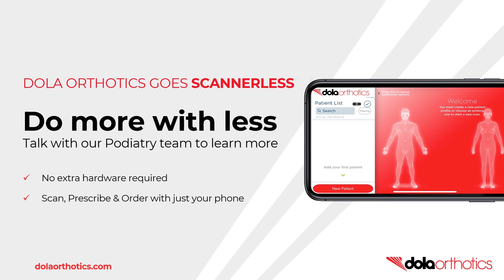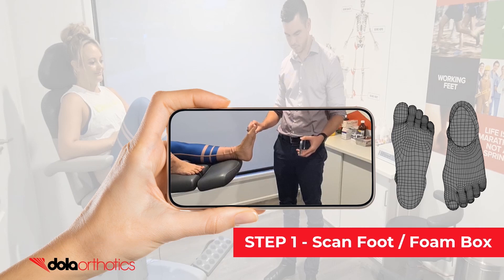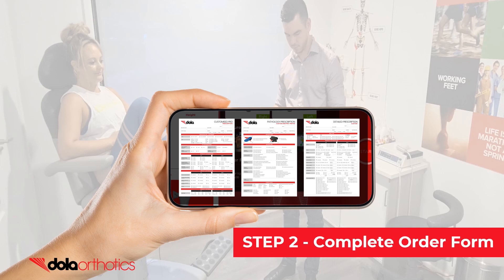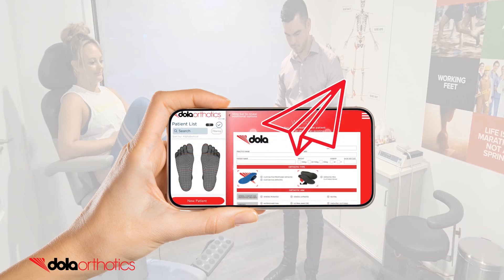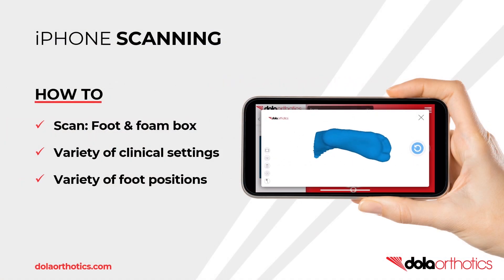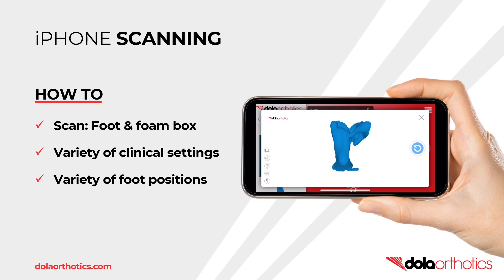Use the iPhone front-facing camera for 3D scanning and DOLA products including the scanning app and iScan adapter. In three easy steps you can use your iPhone to scan a foot or foam impression box, complete a range of DOLA prescription forms for custom and pro orthotics and submit your order directly to our lab. In this video we will show you how to scan both a foot and a foam impression box in a variety of clinical settings and foot positions using the iPhone.